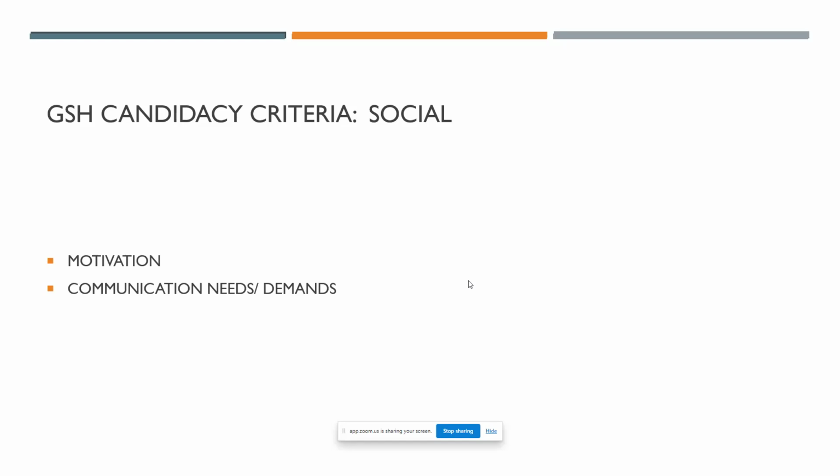And we're also just looking at the communication demands or needs for this patient. Is this a person that is struggling only in social situations, that they find themselves once a month at a family gathering, but on a daily basis they're just on their own, spending time alone at home? Or is it someone that is actually out there working as a receptionist, for example? So, what are these patients' communication needs?